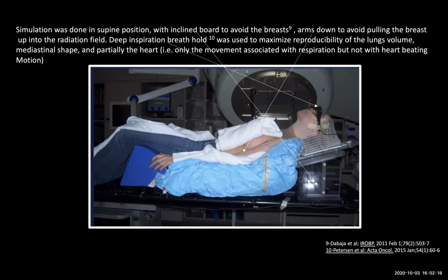This is how we simulate these patients. We pay attention to many details, and I will start from the head going down. As you can see, the patient is on an inclined board, and that inclined board is meant to move the breasts away from the level of the mediastinum, down and outward.